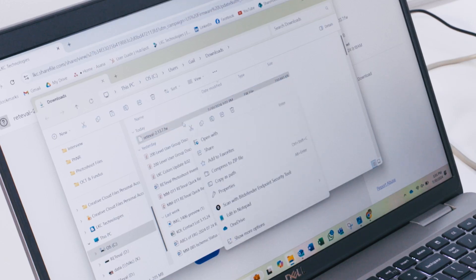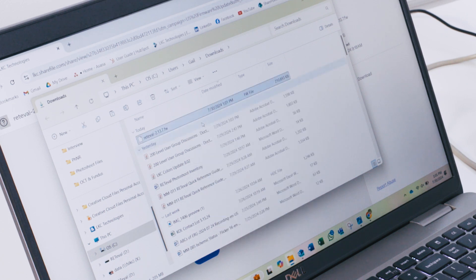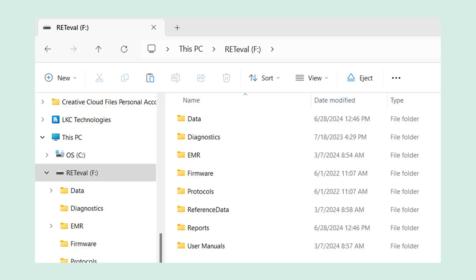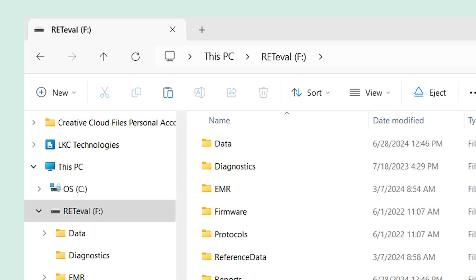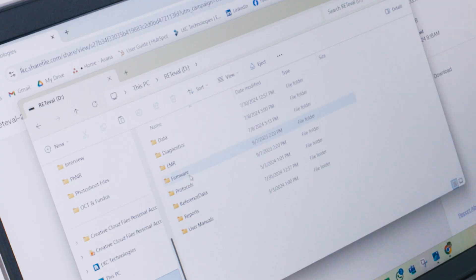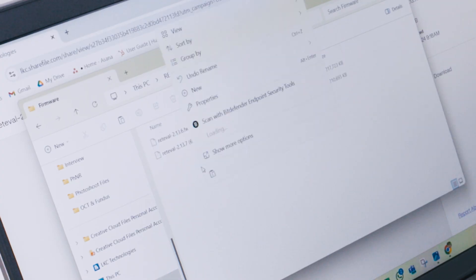Right click on the downloaded firmware file and copy it. Next, navigate to the RETeval folder which will appear as an external drive since your RETeval is plugged into the computer. Locate the firmware folder, open it, then paste the copied firmware file into this folder.